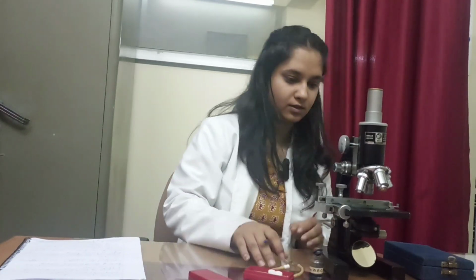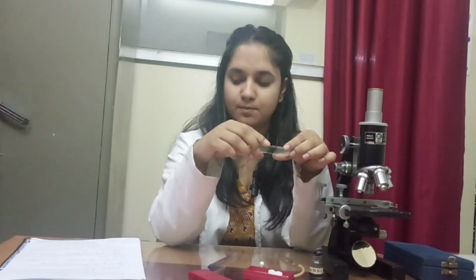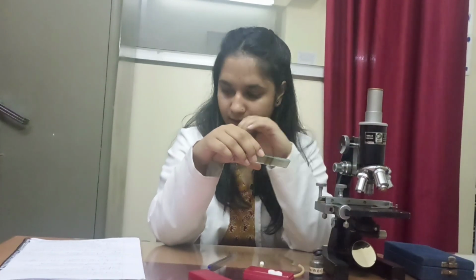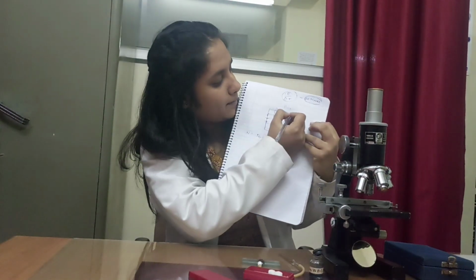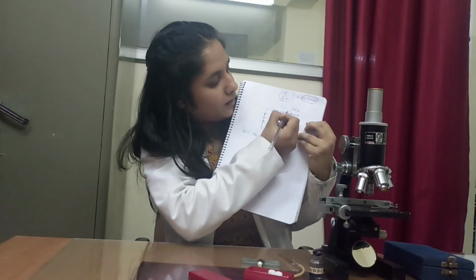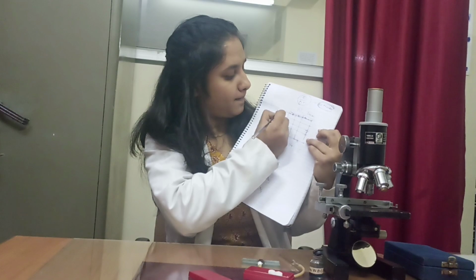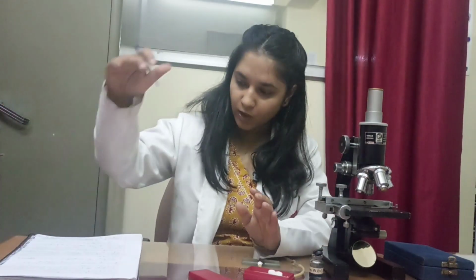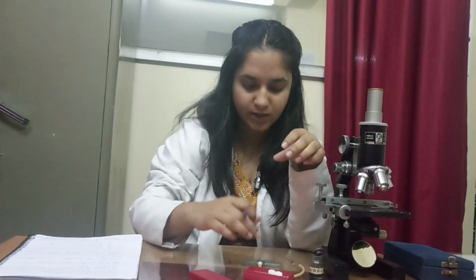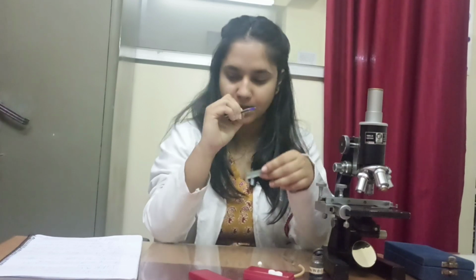After that, we should know about the calculation of the Neubauer chamber. First, the length of 1 square of the WBC is 1 mm, and the width of the WBC square is 1 mm. Length is 1 mm and width is 1 mm. So we have to count the volume of 1 square. The depth of the counting chamber is 0.1 mm or 1 by 10 mm.